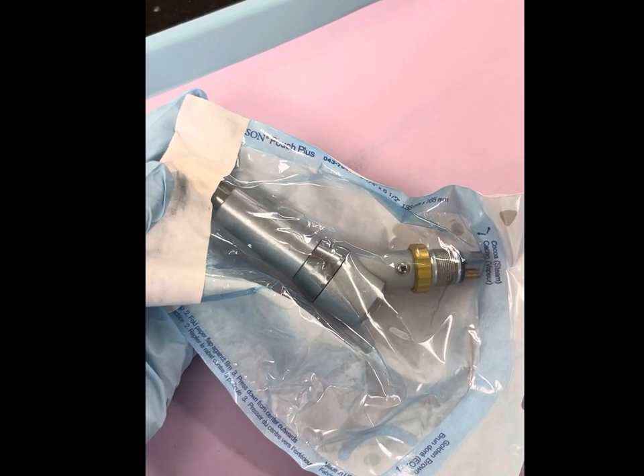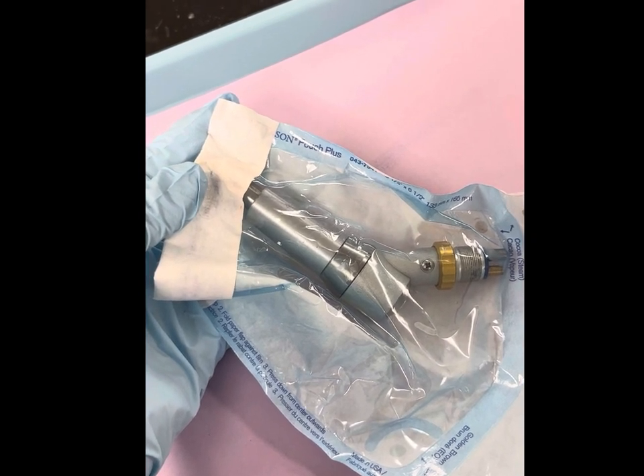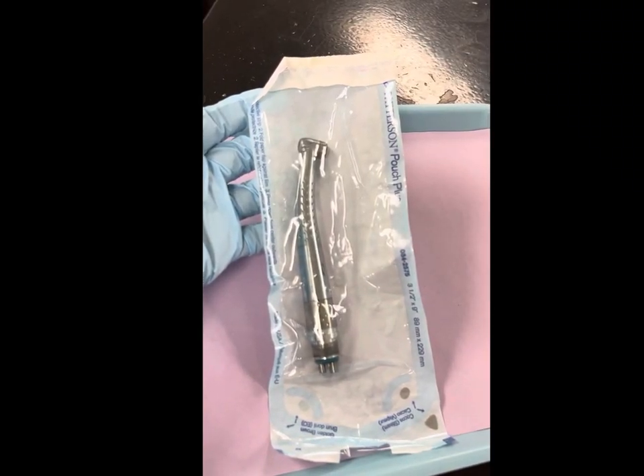This will be the slow speed handpiece used for the removal of soft decay, finishing cavity preparation, polishing, and trimming. Both slow pieces and high pieces will be used with burrs, stones, or discs.